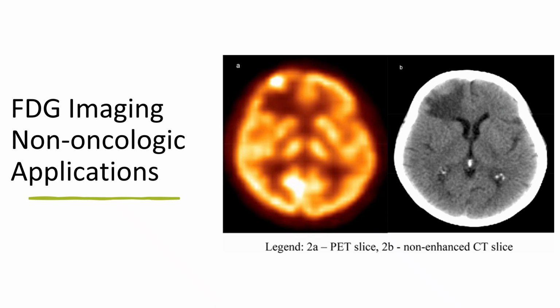Hey class, welcome to this lecture on FDG imaging of the brain. And this lecture focuses on the non-oncologic applications of FDG imaging.